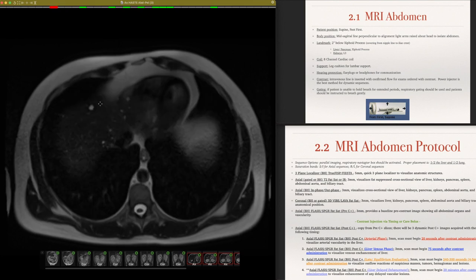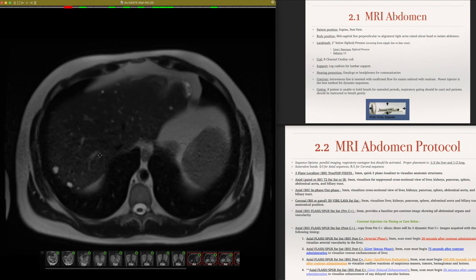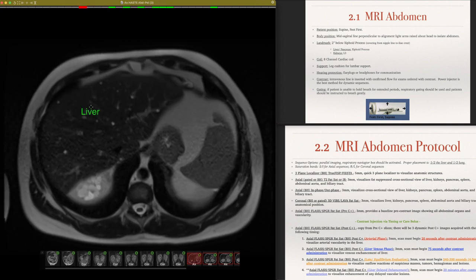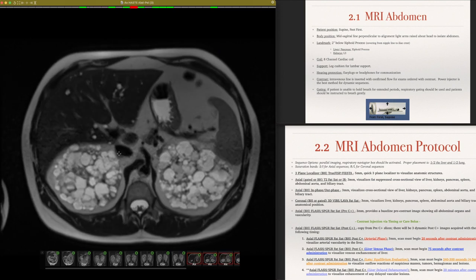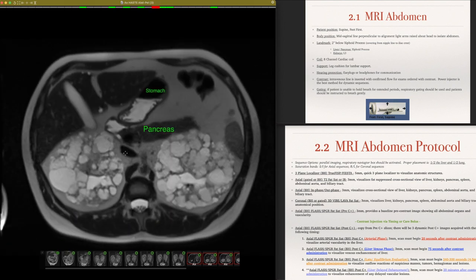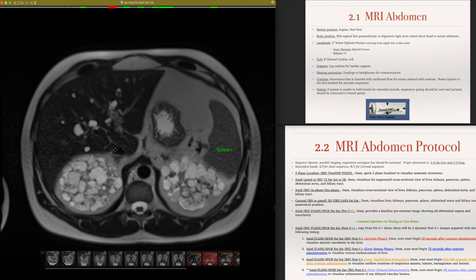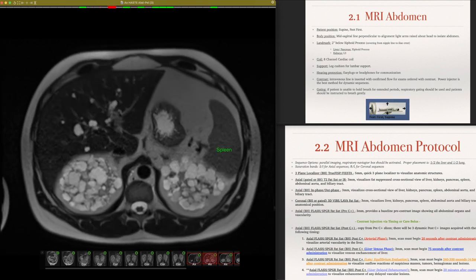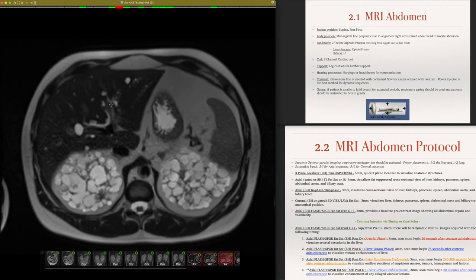Again, we can start to see these hepatic cysts, quite a few, some larger than others. So this is the liver. When I say hepatic, that's the anatomical term for liver. Okay, we can start to see the IVC here. And when I was mentioning before, that's how we know, because it's coming from the right side, because it moves into the liver as well, towards the liver. All right, so scrolling back to the top, you're able to see a whole bunch of these cysts that were deep within the liver that we saw on the coronal view. Now we're able to localize them and see where spatially they are within the body.